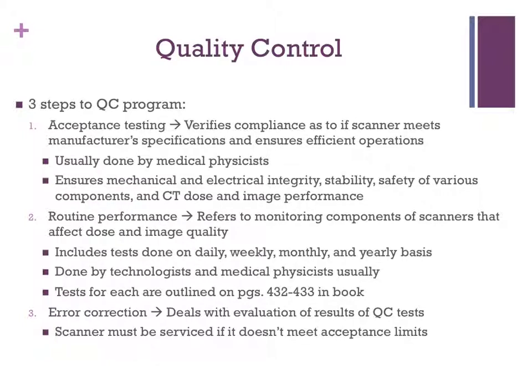Routine performance is another step to a QC program, and this refers to monitoring the components of scanners that affect dose and image quality. Monitoring includes QC tests that are performed on a daily, weekly, monthly, and yearly basis. Techs are pretty active in routine performance evaluation of the scanners, but some of these tests do need to be completed by a physicist.